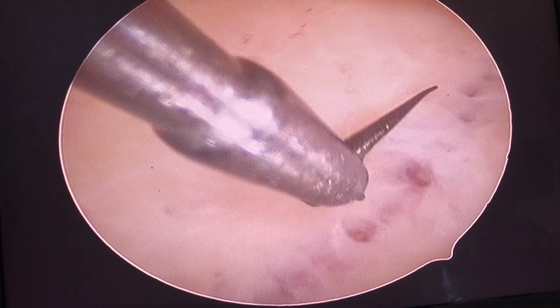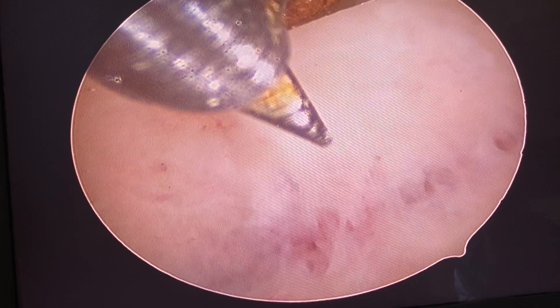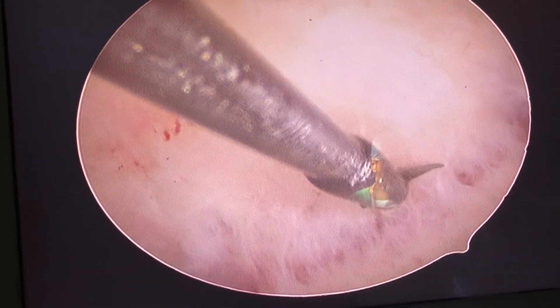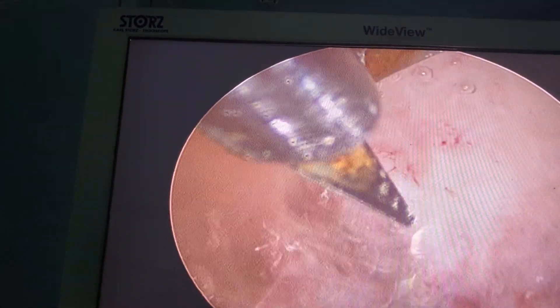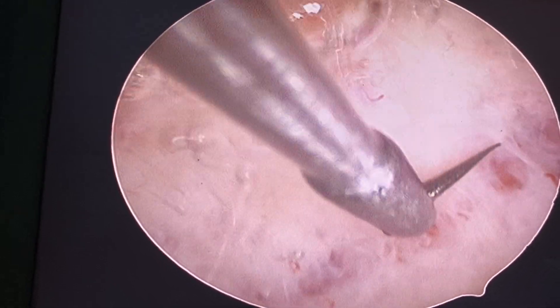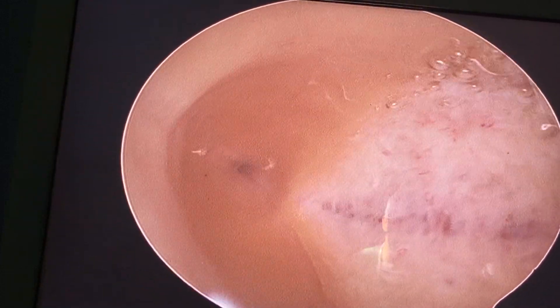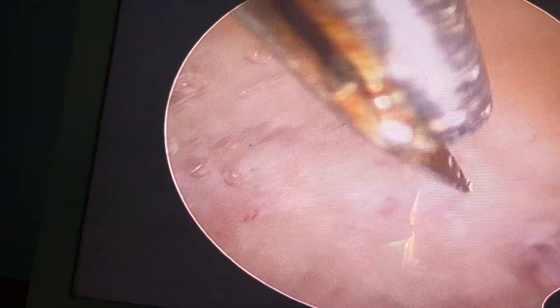When I ask the nurse to do something, she has to confirm by saying 'done.' Just bite, don't cut like this. Very gently — just the tip of the scissors. I think this is enough. One bite here, one bite there. You see how to play with the scissor? Scissor and lens — this is playing with the scissor and the lens.